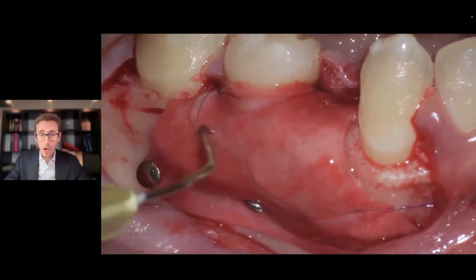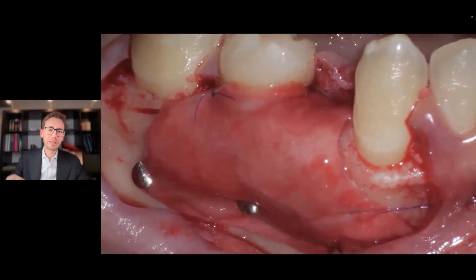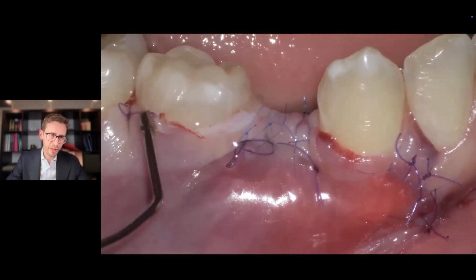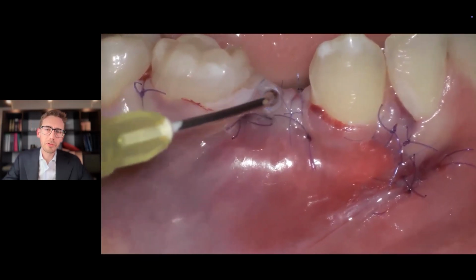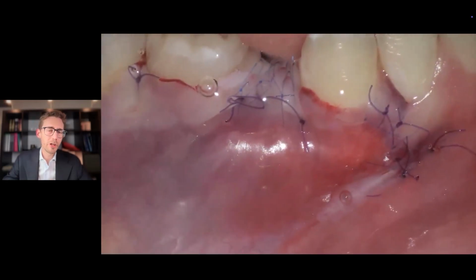And once the membrane is perfectly stabilized to achieve primary stability of the material, we apply our second layer on top of the membrane, which of course does not target the membrane itself. The membrane is simply a vehicle to apply RegenFast in contact with the periosteum of the closing flap. And finally, if we have some additional material available, we can apply the product on top of the suturing line in order to promote soft tissue healing at very early stages of the postoperative period.